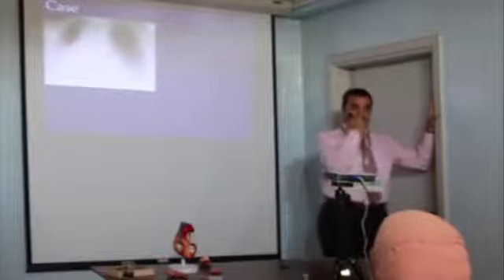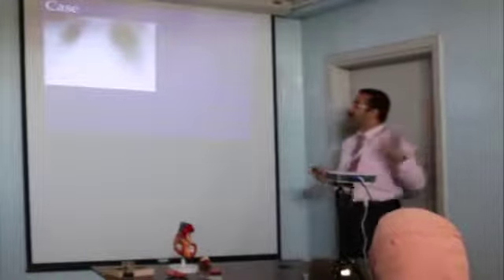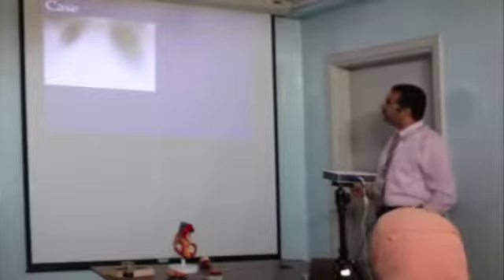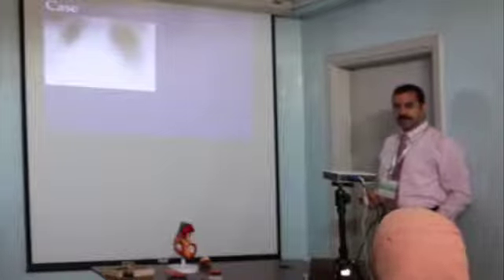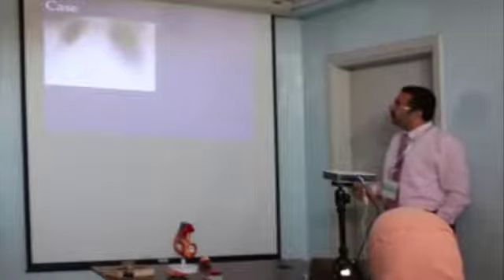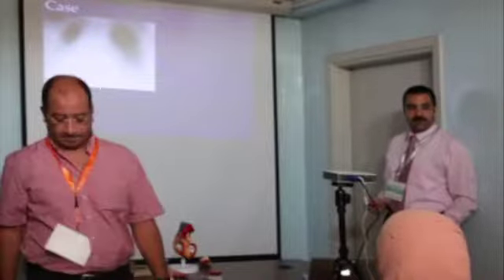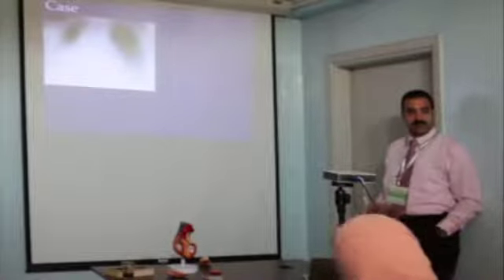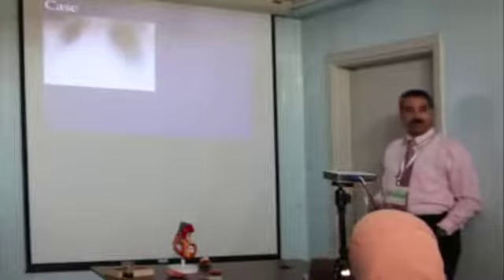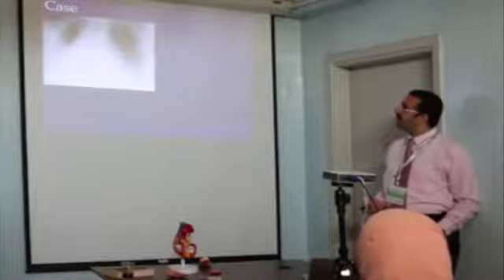This is an X-ray for an ICU patient. What's your impression for that snap? There's no aeration here. Because of what? Maybe collapse and pneumonia. The bilateral collapse in the chest. Of course, it will be bilateral. Maybe something else, like what? What do you think? Give me one of the differential entities. Consolidation, pneumonia? Could it be pulmonary edema? It doesn't have the fluffy appearance. This is so bad already.